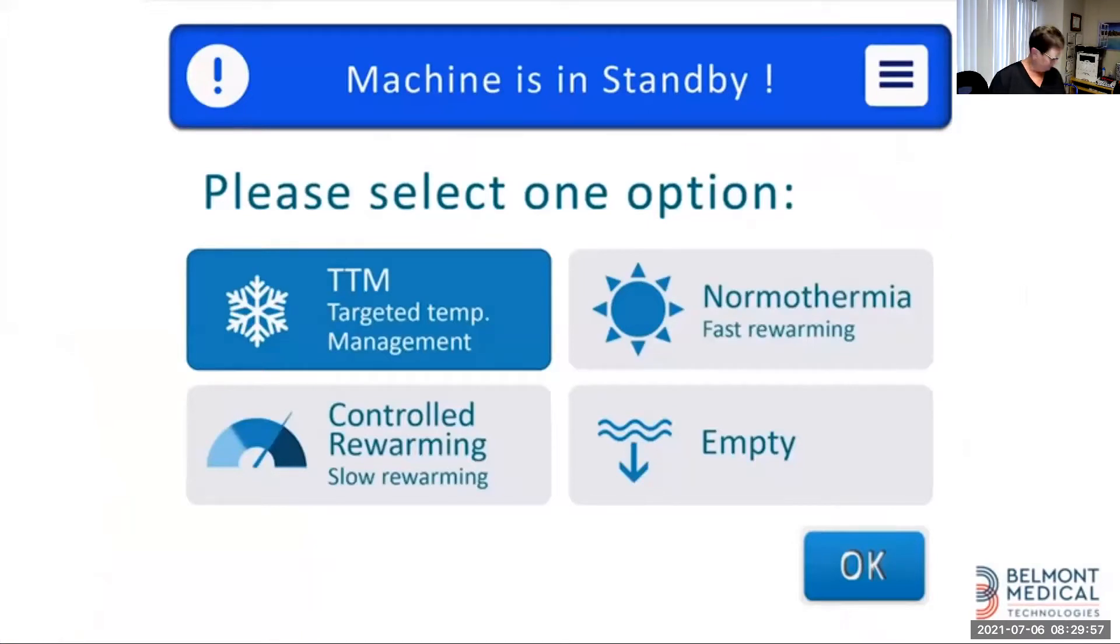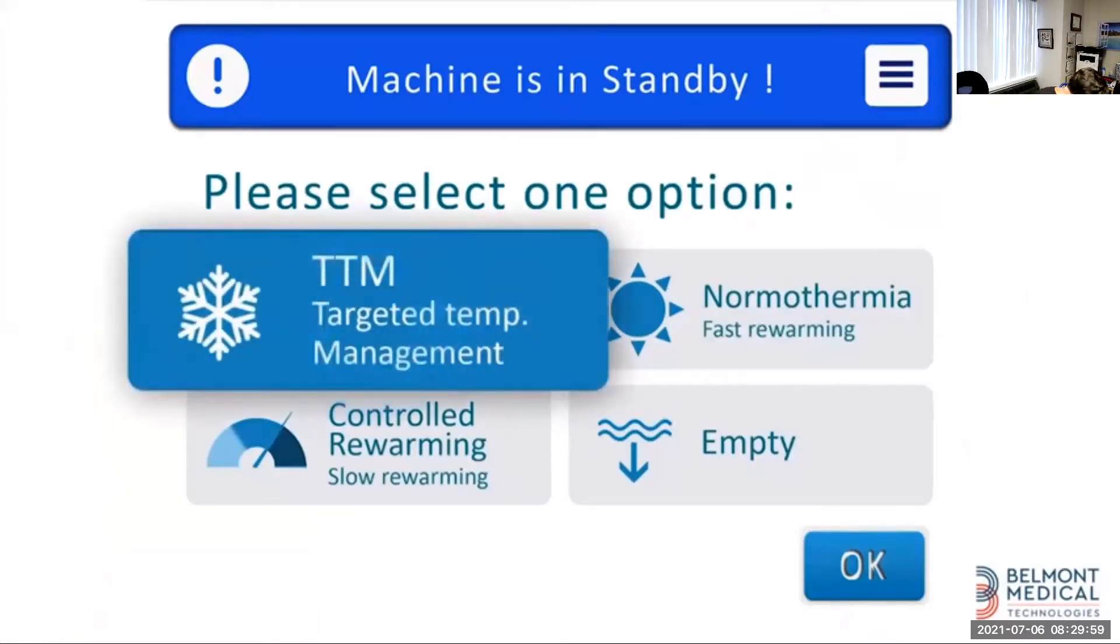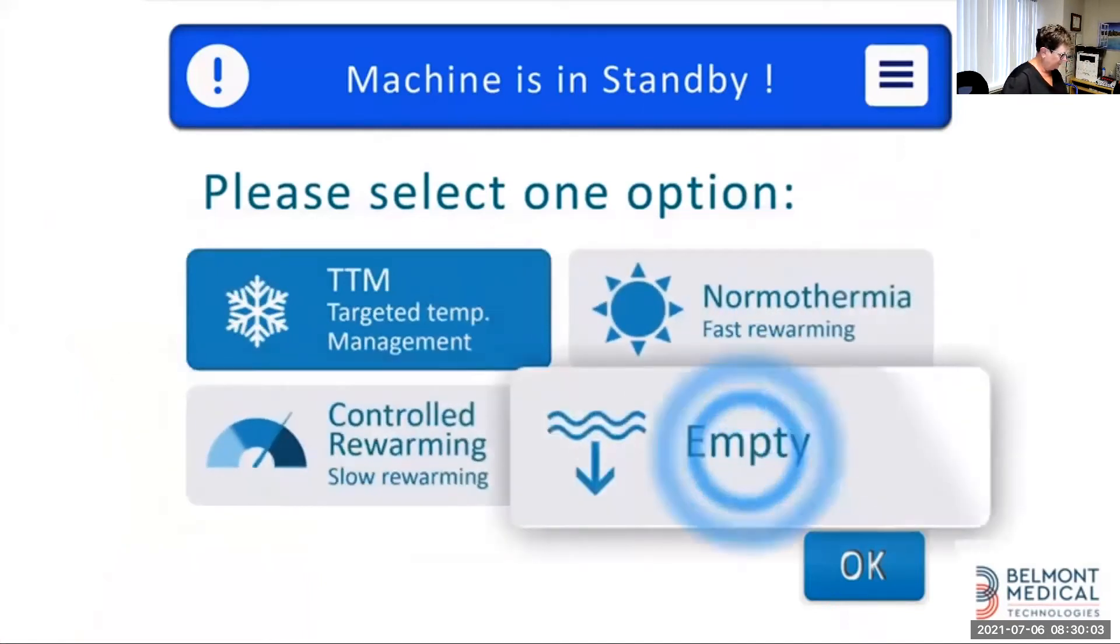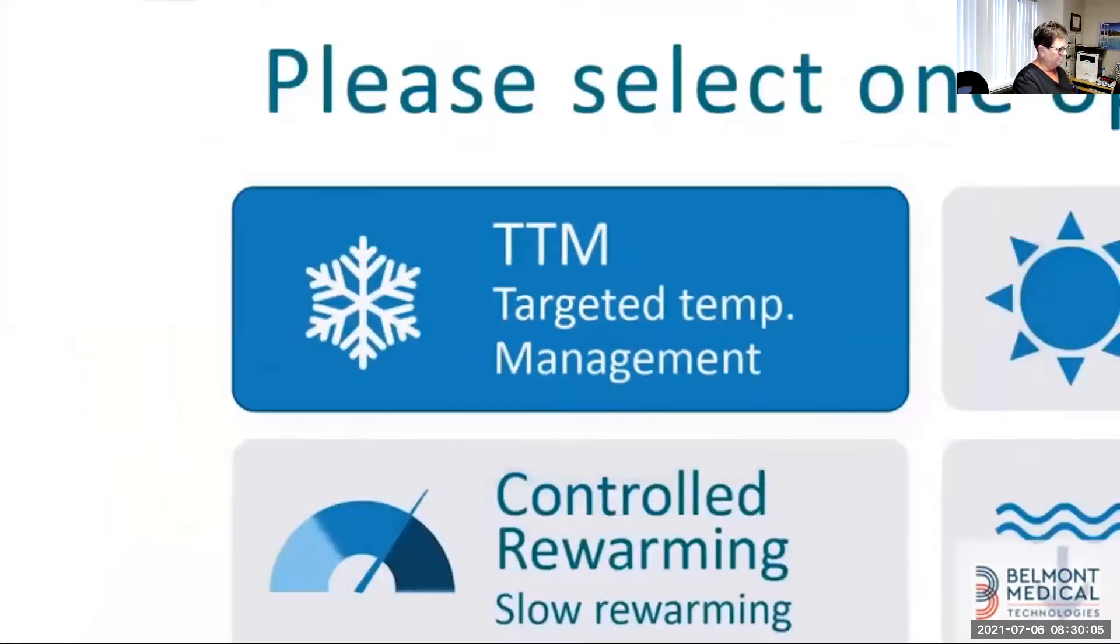Now, you can select the operation mode. The options are targeted temperature management, normothermia, controlled re-warming, and empty. Select TTM for controlled targeted temperature management. This is the default choice.